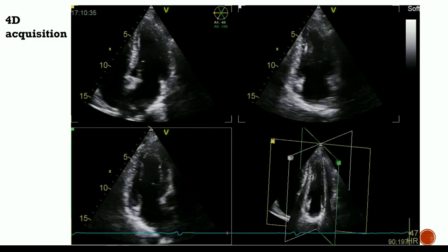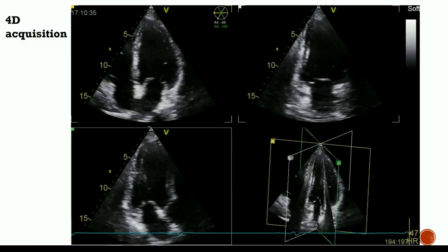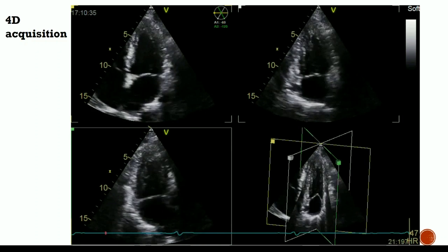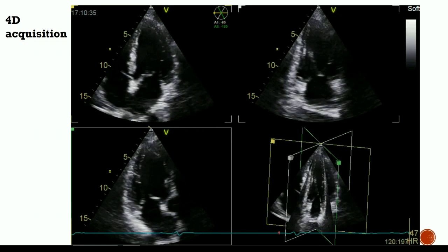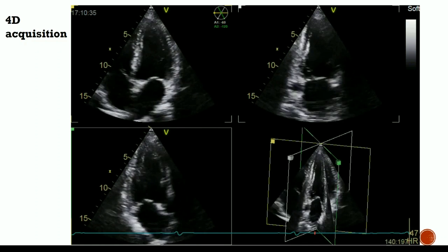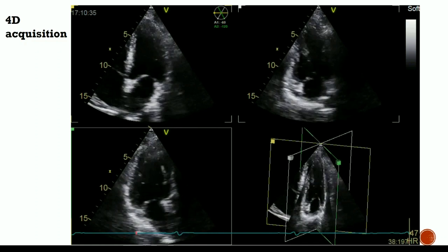If you do one strain report from your machine, but they go elsewhere a year later and get another report and it's slightly different, how much of that is due to inter-vendor differences versus a true drop? I think it's more telling if there's a change in strain done on the same machine as opposed to different ones.